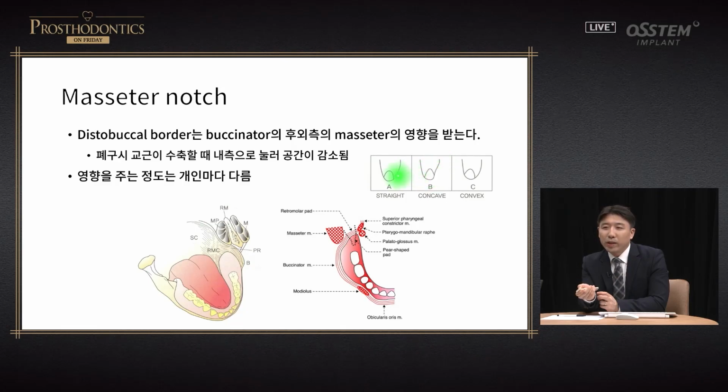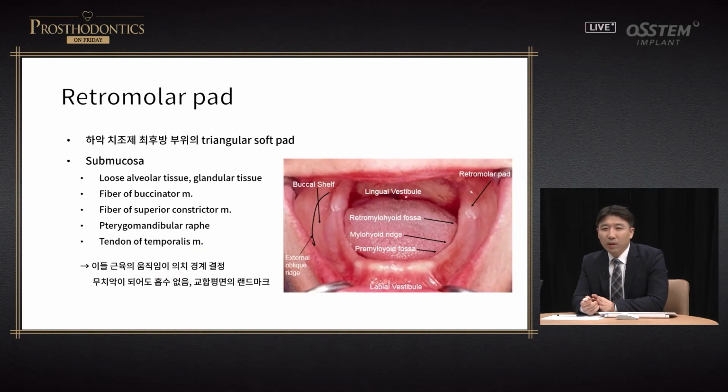In general, first we make a straight design, and with patients with a highly developed masseter muscle, the patient will complain of severe pain at times. Then you need to make it concave for the patient to use it more comfortably. Please remember the masseter notch.